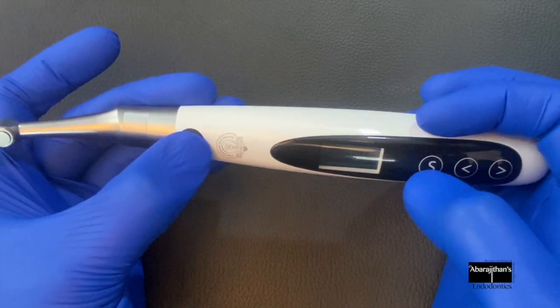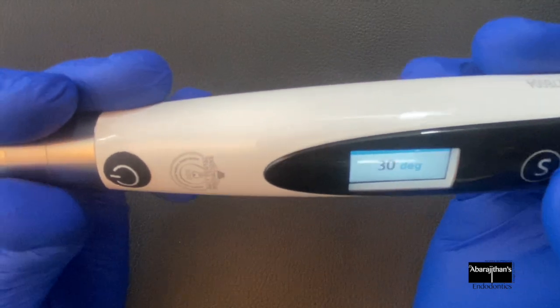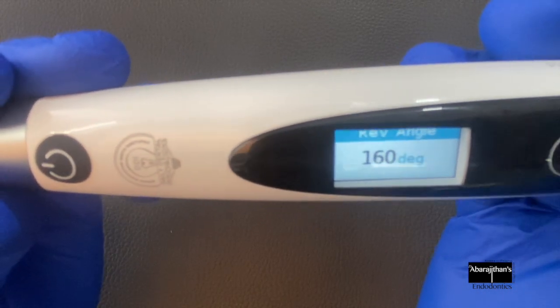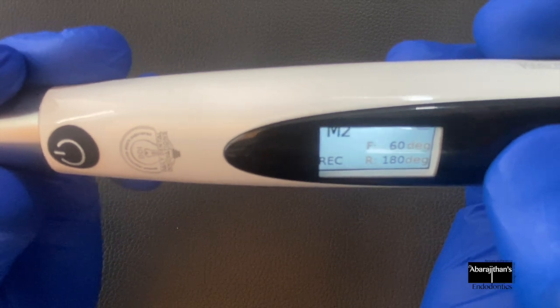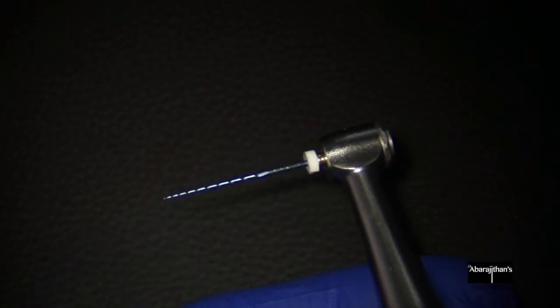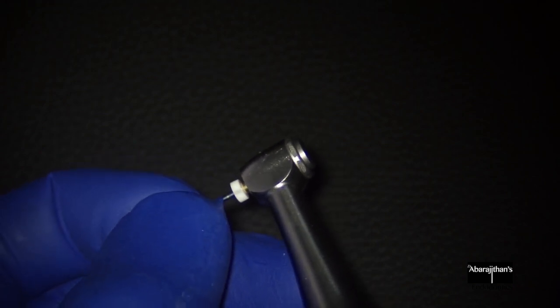The reciprocating angles can be set based on the need depending on the reciprocation file that you use — which is called an open reciprocation angle endomotor. It also has the ACC or ATC mode. The ACC mode is more similar to the automatic reverse when it encounters a particular torque. The ATC mode is similar to the ATR mode in the J Morita handpiece.